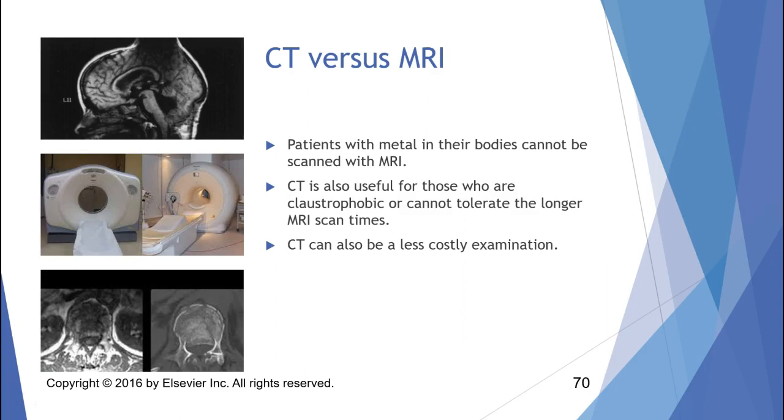Okay, this middle picture is just a CT scanner, the one on the left, a regular GE CT scanner. The one on the right is the MR scanner. So there is a claustrophobia element involved. There are also much longer MRI scan times.